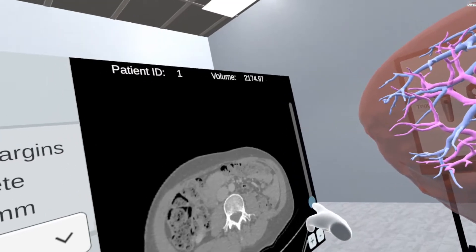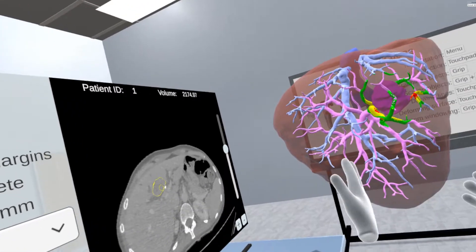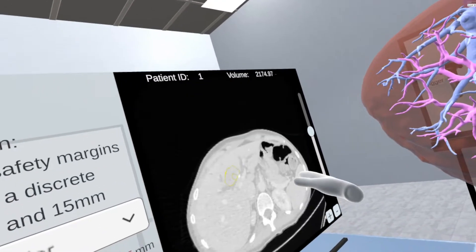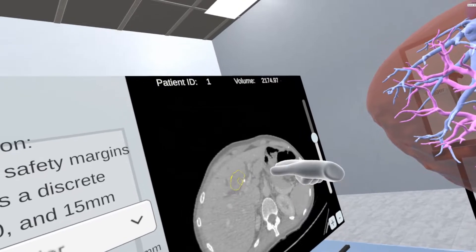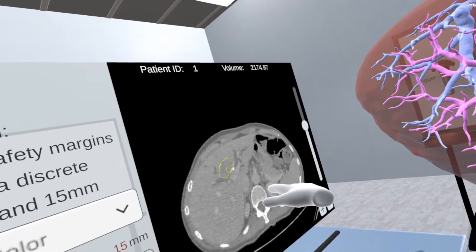Since the tumors and vascular systems are important for resection planning, the system also allows the users to explore the patient data in 2D view. The users can move with their VR hands representation to adjust the image brightness and contrast for viewing details of inner structures.